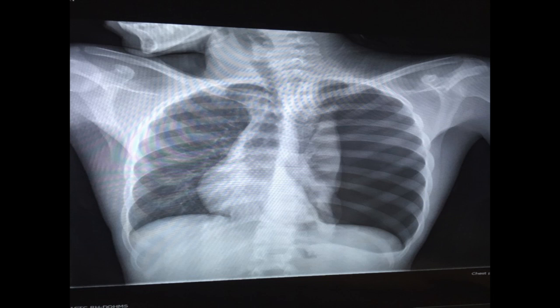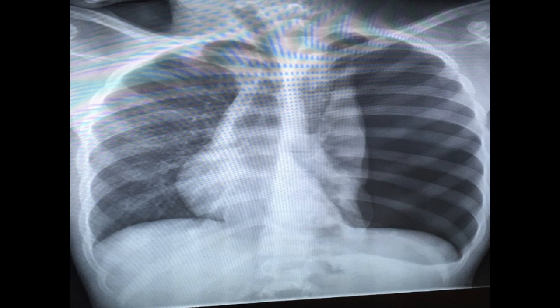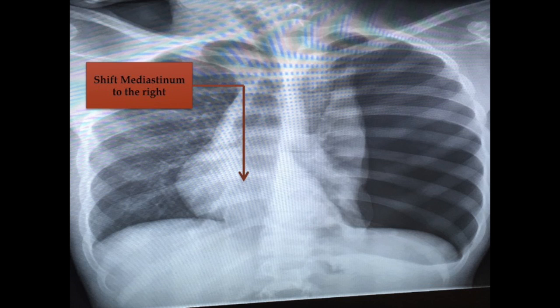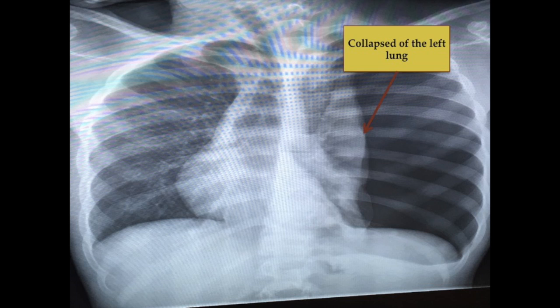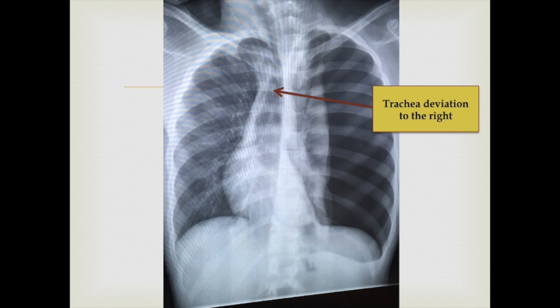This is the same view, now magnified. The first finding in this chest x-ray is shifting of the mediastinum to the right side. The second finding is a collapse of the left lung. The third finding is trachea deviation to the right side.